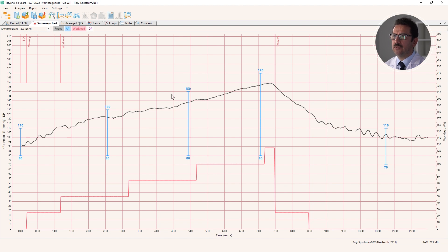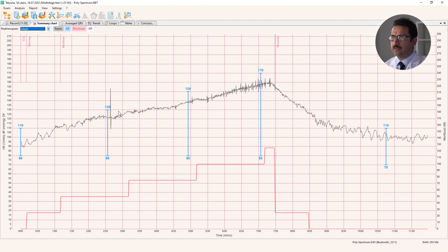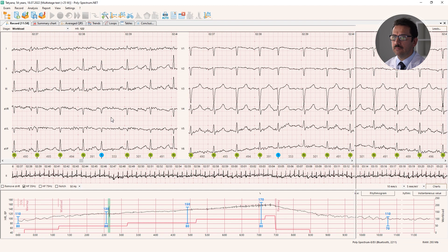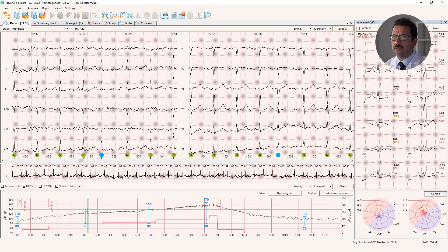Without the details, for example some small change due to artifacts or arrhythmia, I'm switching to the simple view. Now I can see the different deviations from the main heart rate line. The most interesting is quite a big spike that may be caused by extrasystole. To check if this is extrasystole I can double click here.